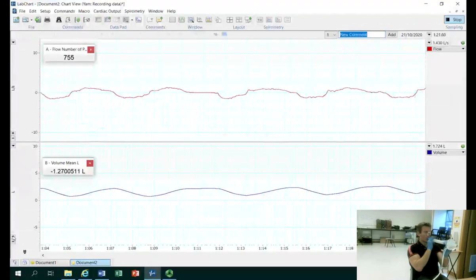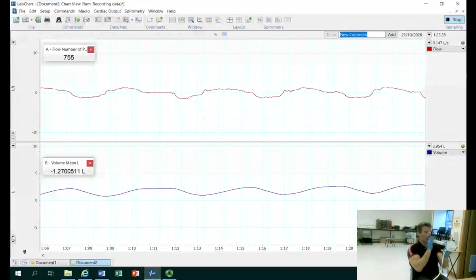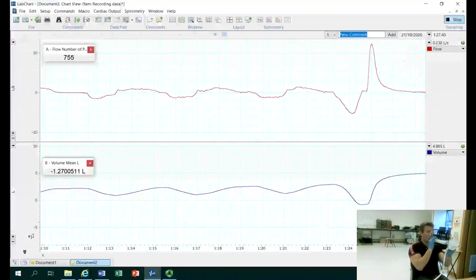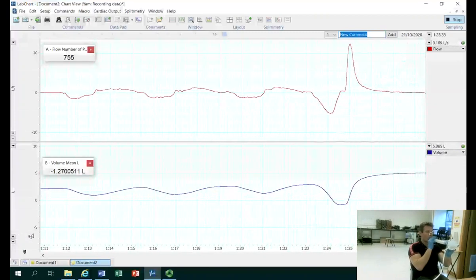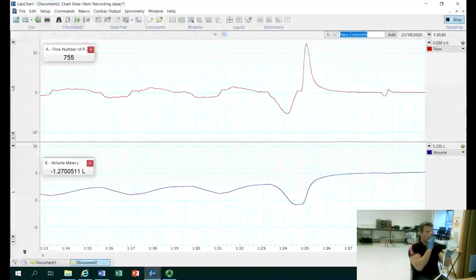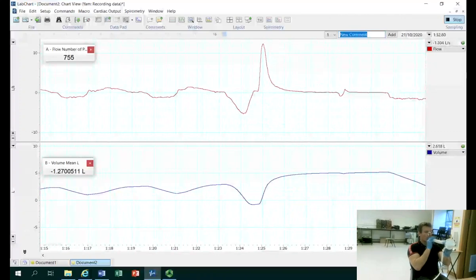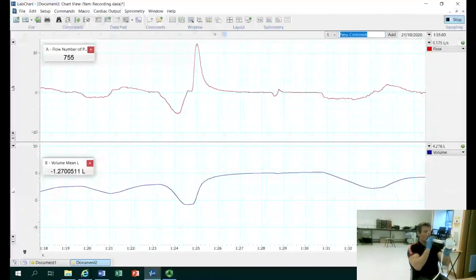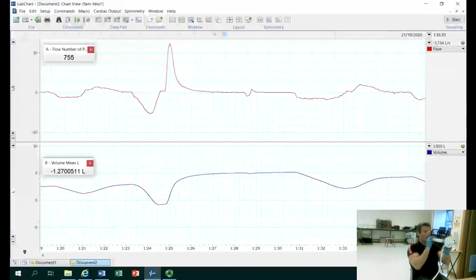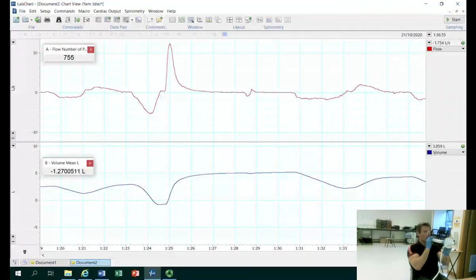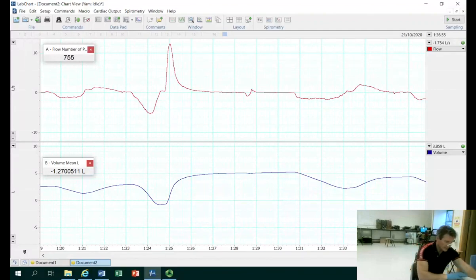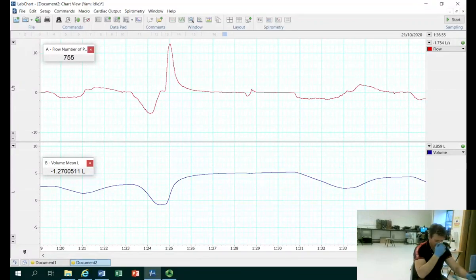The participant then performs the forced expiration maneuver — blowing out as hard and as long as possible until all air is expelled. This finishes the data collection piece of the lab, and what we want to do now is analyze the data on screen.